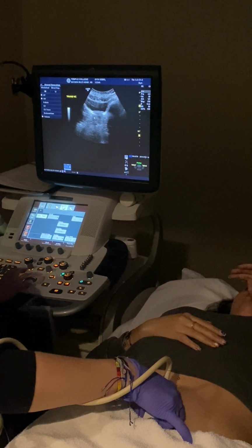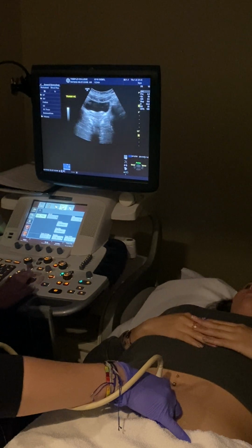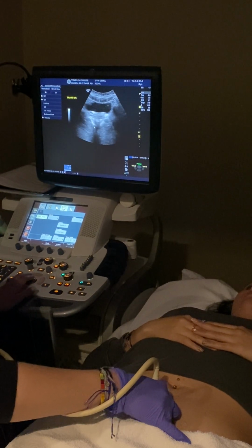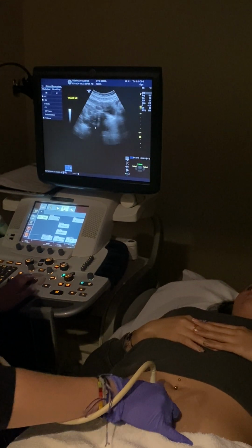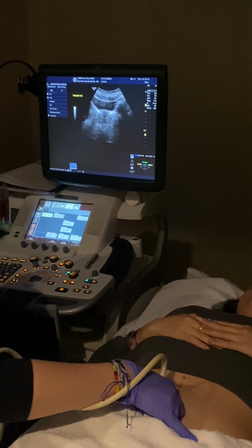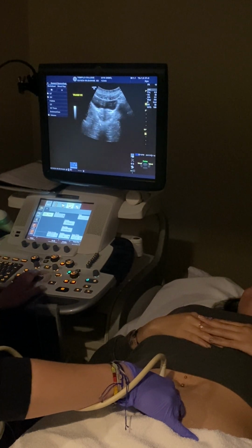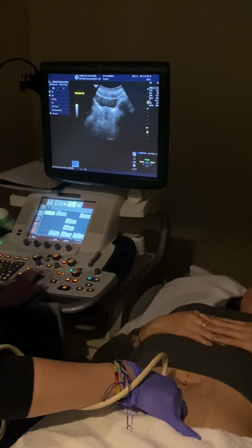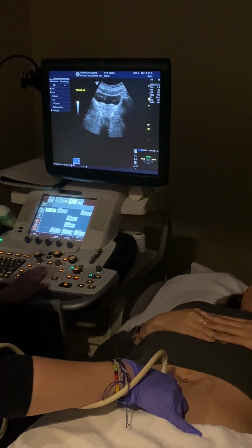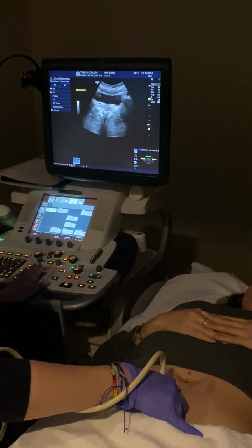I'm inferior, going way past her vaginal canal. Uterus? No, uterus is going to be going superiorly. It's her rectum. You are correct. We don't need to image that. So, when you've gone too far, that's what it's going to look like. That's her rectum. That is vaginal canal. You see the stripe right here? Okay. So then we're going to keep going.